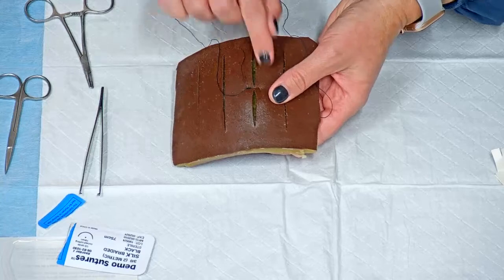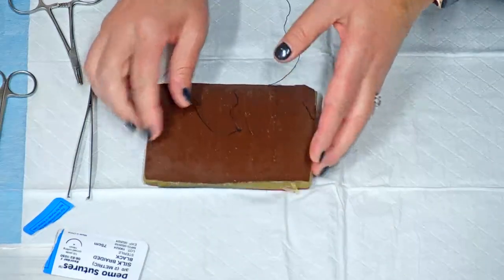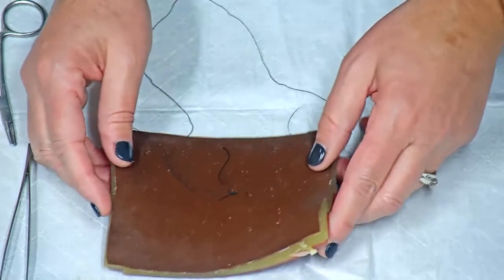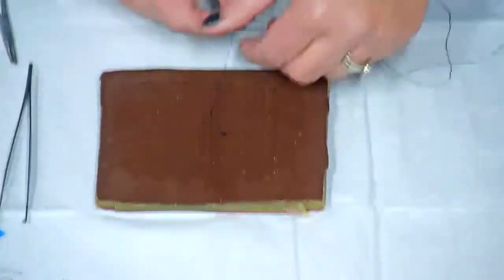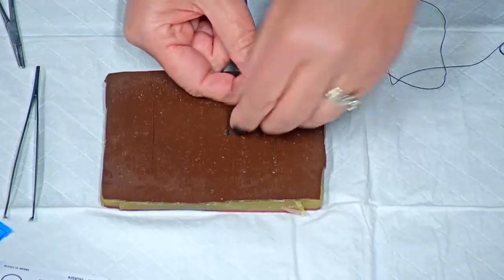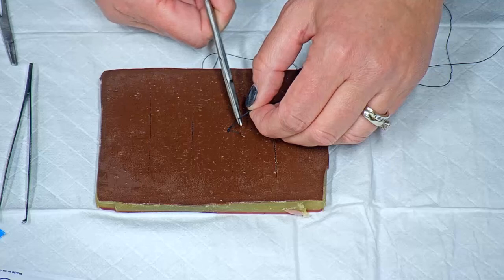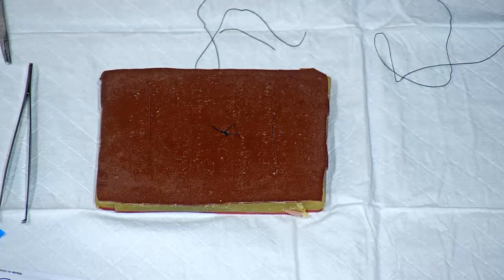that suture is really pretty equidistant to either side so that there's not tugging. That skin is a little bit approximated, and the knot itself is not directly above the wound. We put that off to the side. What we'll do now is you want to trim the tails. And again, that 5 millimeter is a great rule of thumb, just enough so when you remove it, you'll be able to have something to hold on to. I'm going to go ahead and snip that. And that will be one simple interrupted suture.